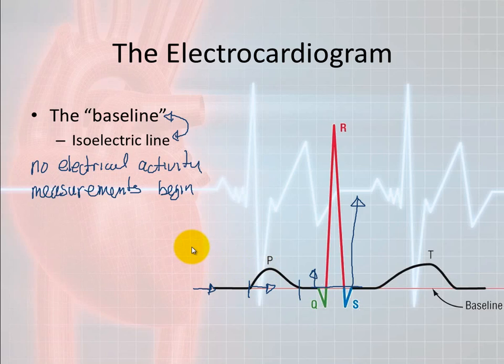So this is something that you're going to hear several times. When I talk about wavy baselines or bad baselines or an isoelectric line, where is the isoelectric line? This is what I'm referring to.